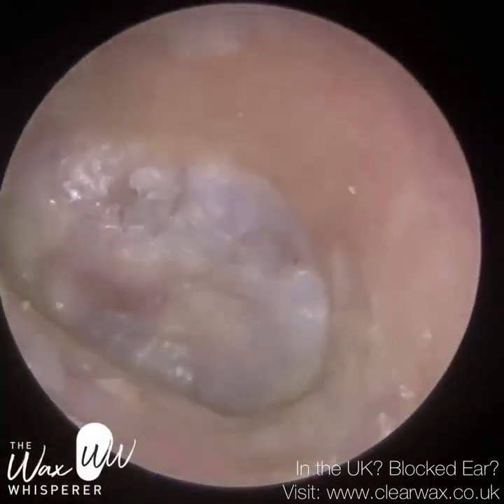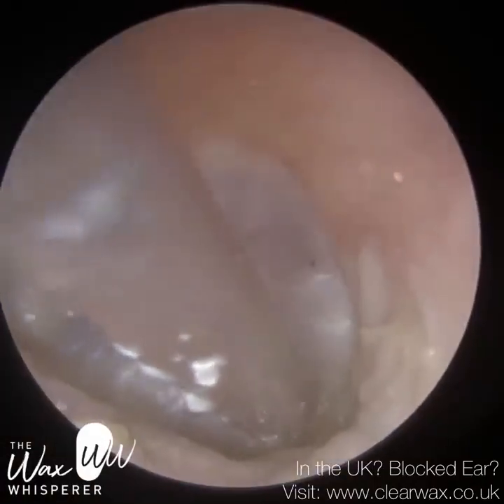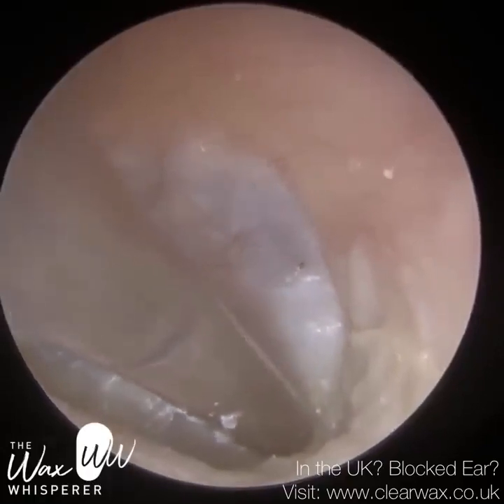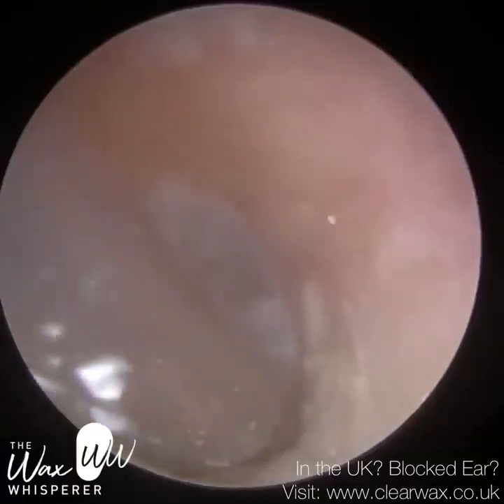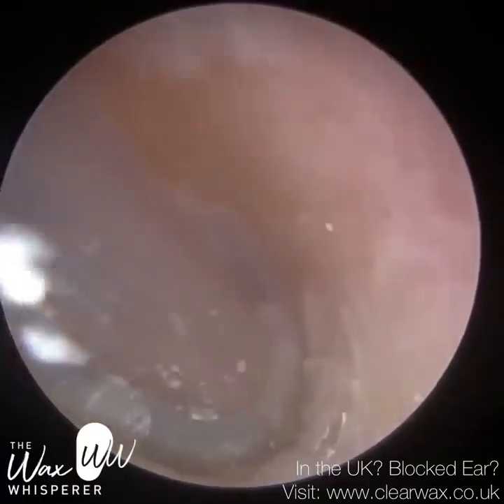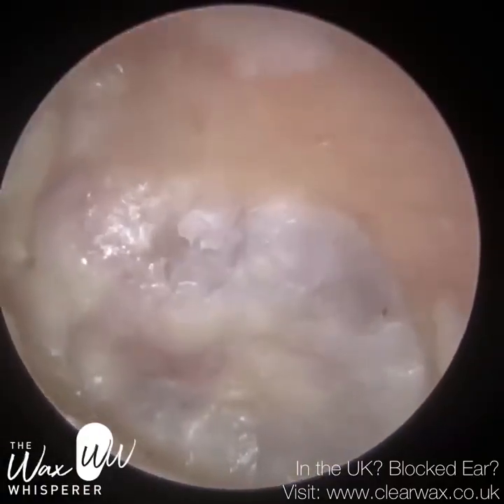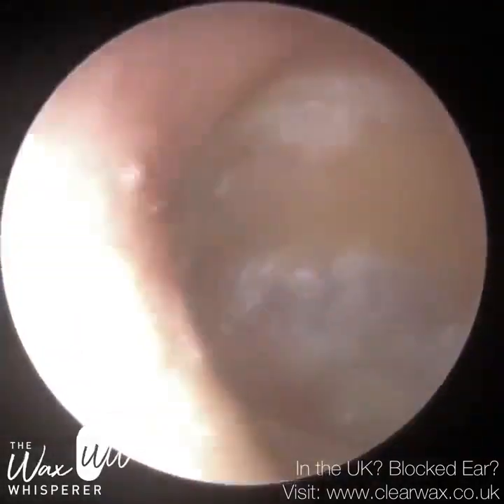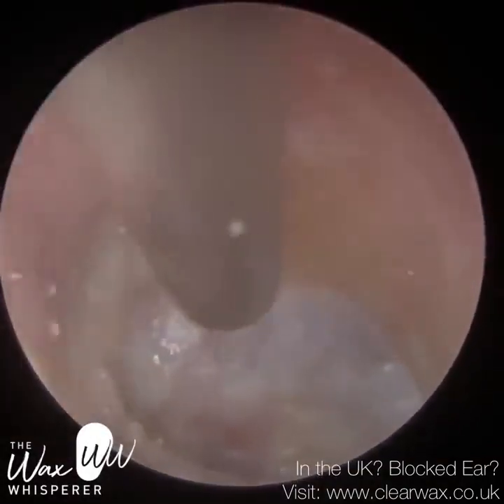I think there's a bit of debris there. I managed to remove that still, but we've got to be careful because whenever we're working close to the eardrum, we don't want to perforate the eardrum. The eardrum is a lot more resilient than people imagine it would be. That doesn't mean that it's indestructible. It is very fragile, but considering it's roughly 0.2 millimeters in thickness, it's a lot more stubborn and resilient than one would imagine it to be, being only that amount in thickness.